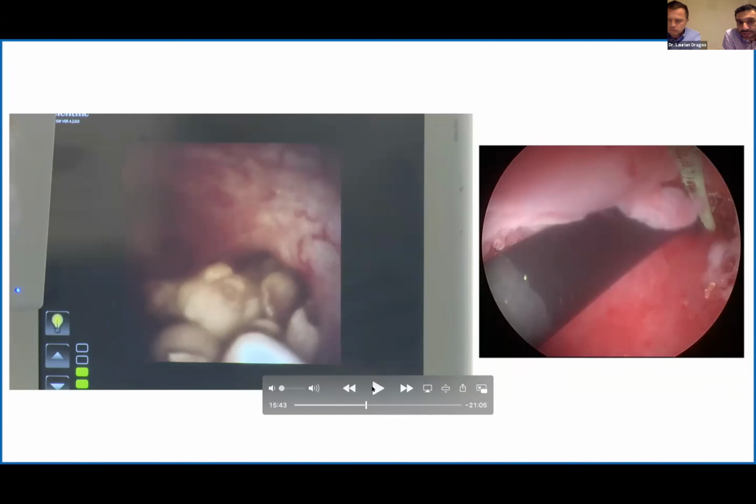And if there's a collapse, then as Kay said, you can close your outlet, decrease the suction in order to prevent the collapse of the system. So I fully agree with Kasra. It starts with the puncture, if it's well done. Sometimes you do the puncture correctly, and then the infundibulum is very tight, and then you have bleeding because you're dilating the infundibulum. It was not the case in our situation.